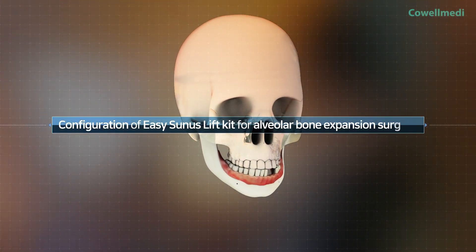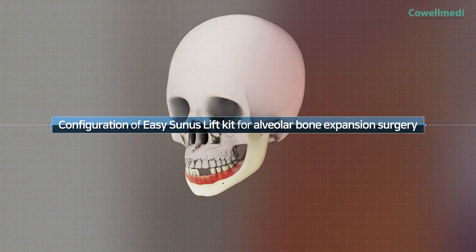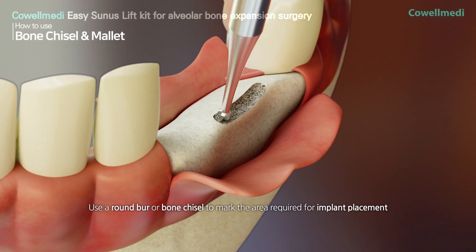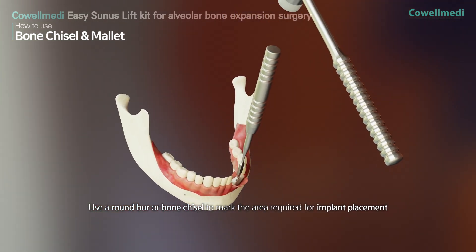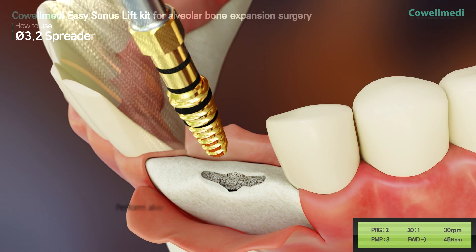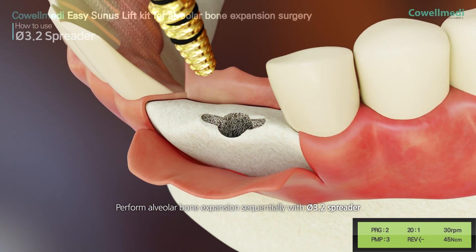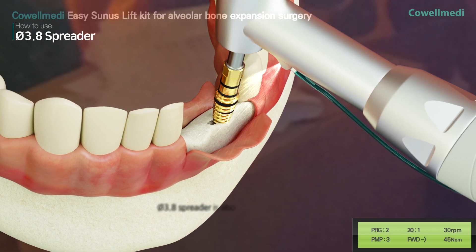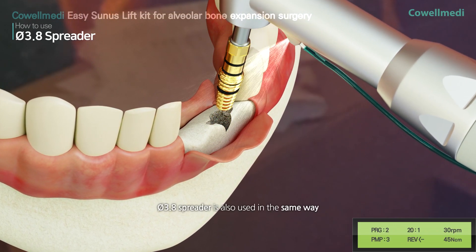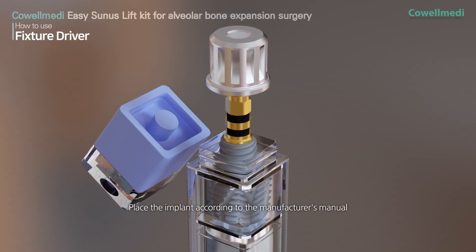The next step is to use the Easy Sinus Lift Kit for alveolar bone augmentation. Use a round burr or bone chisel to mark the area where the implant needs to be placed. Sequentially perform alveolar bone expansion with the PI 3.2 spreader, then apply the PI 3.8 spreader in the same way.